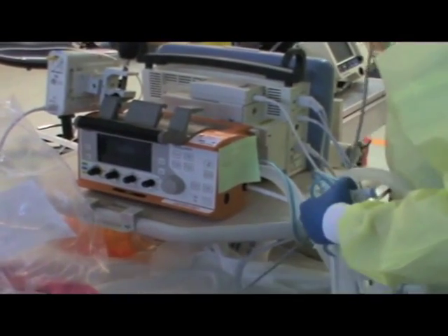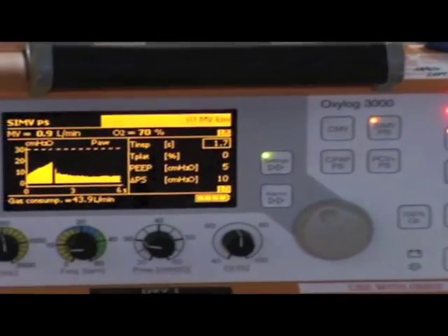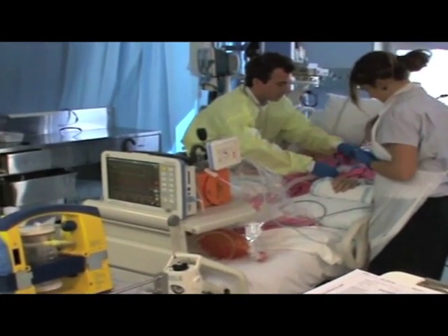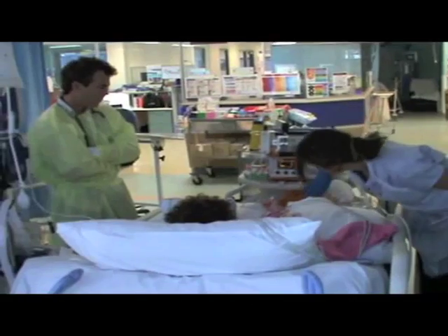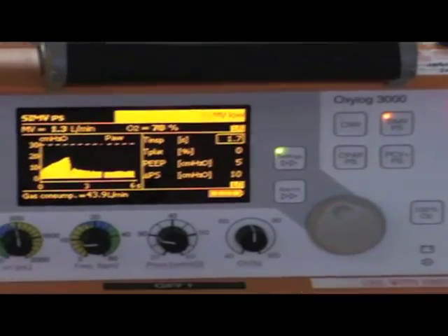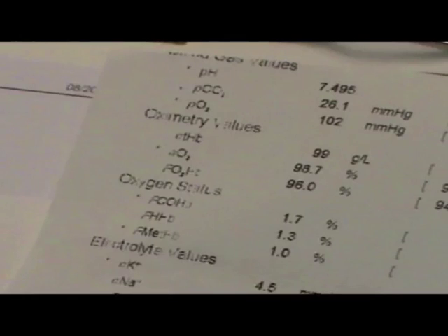Set up the ventilator ahead of time to ensure that it is working and tested. Consider ventilating the patient on 100% oxygen during transit to give you extra time should the endotracheal tube be accidentally removed. Change the patient onto the transport ventilator circuit early, particularly if they have sick lungs, so that you can be sure that the patient will tolerate the change. If time permits, test your settings by getting a blood gas immediately prior to departure.